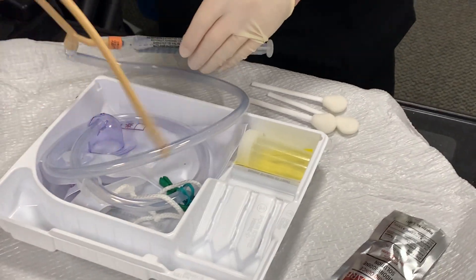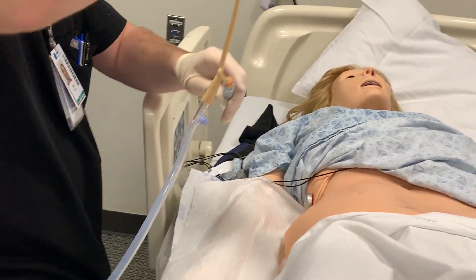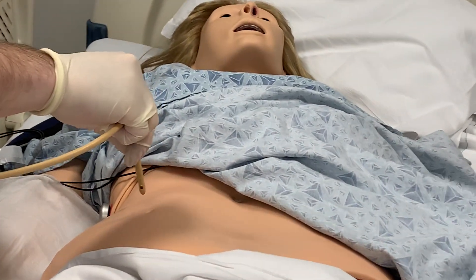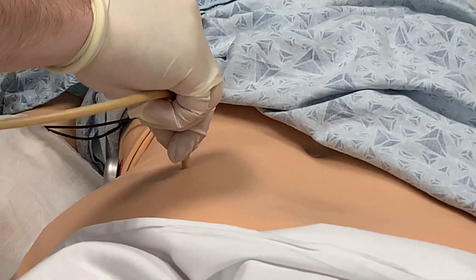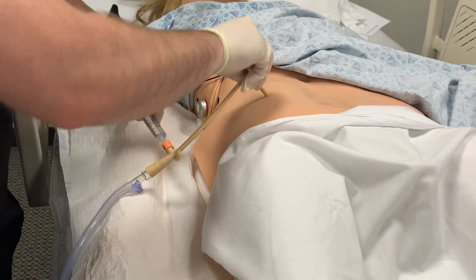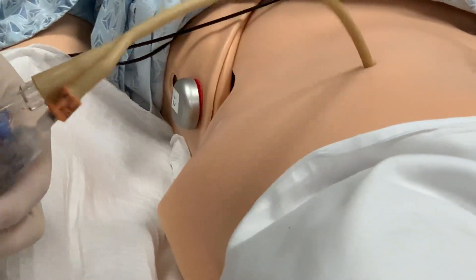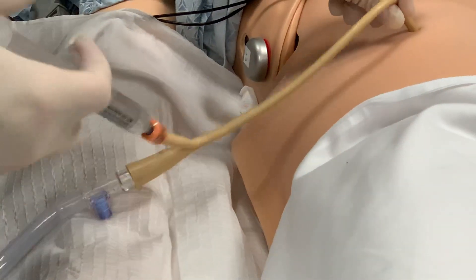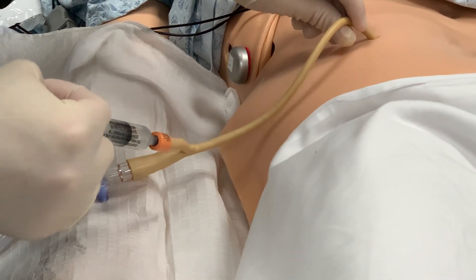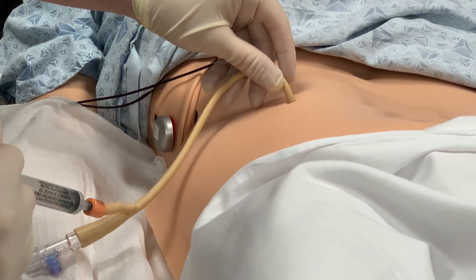When we insert our catheter, we want to go in about four inches, feeling for the catheter hitting the back of the bladder. Be careful not to touch anything with the catheter as we insert it. We're going to insert our catheter, looking for urine return in the tubing. This is a simulation so we won't see urine return, but once we do, we can go a little bit further, and we should hit the back of the bladder at about four inches — then we will inflate our balloon. Once the balloon is inflated, we will pull back on the catheter to make sure it's seated in the bladder and doesn't come out.